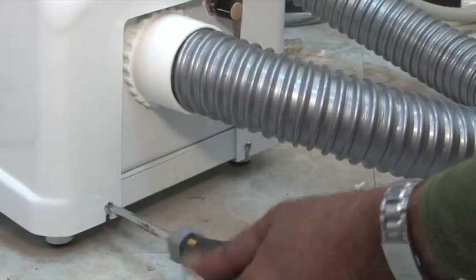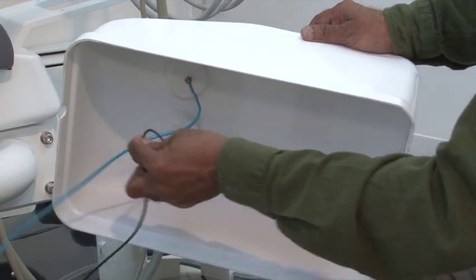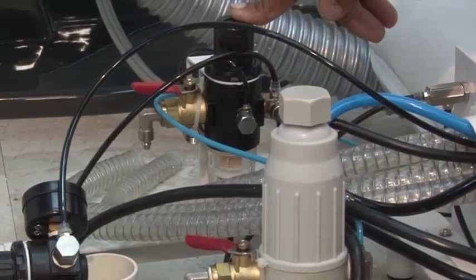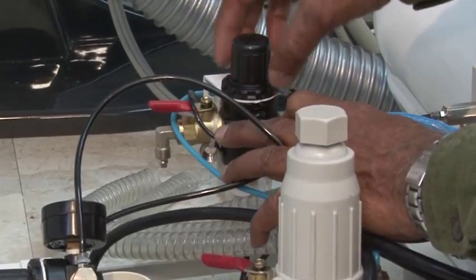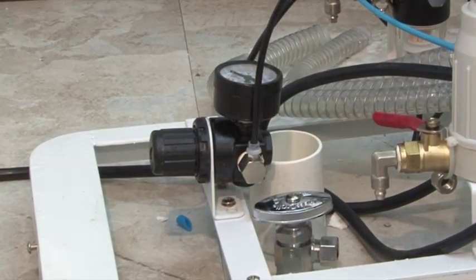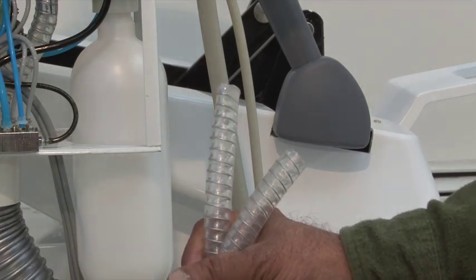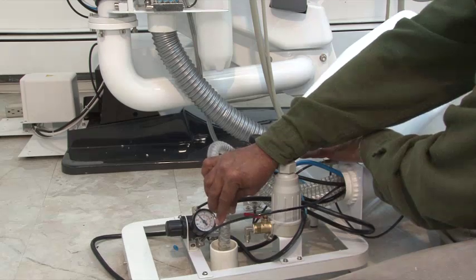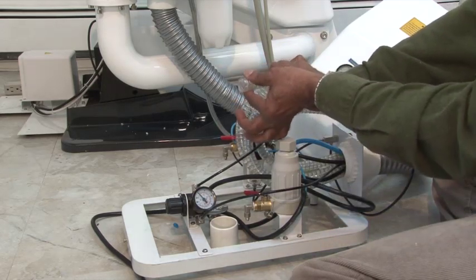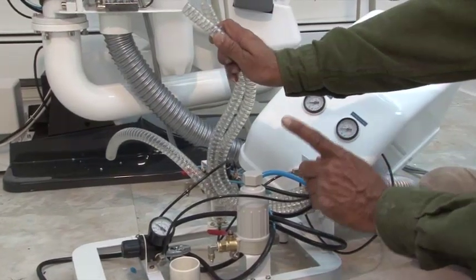Now remove the two screws in the J-Box cover. Inside, the blue tube connects to the water pressure gauge, the black tube is for the air pressure gauge, there is a water filter, and the air regulator allows you to adjust the air pressure — it defaults to factory settings. There are three clear tubes: one large tube is for drainage and the two smaller tubes are for high and low suction. Connect the larger clear tube to the drainage line. If you use external suction, you may use a Y or T connector to connect it into a suction unit. If you are using the internal suction, you may insert these two tubings into the drainage line as well.